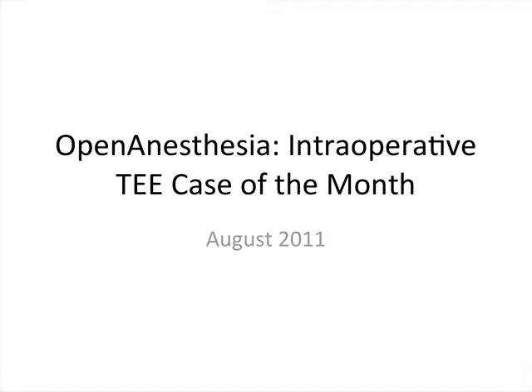This is Dr. Julie Huffmeyer with our Open Anesthesia Intraoperative TEE Case of the Month for August 2011. Each month, we will feature an operative case which teaches or emphasizes an important aspect of basic intraoperative TEE.